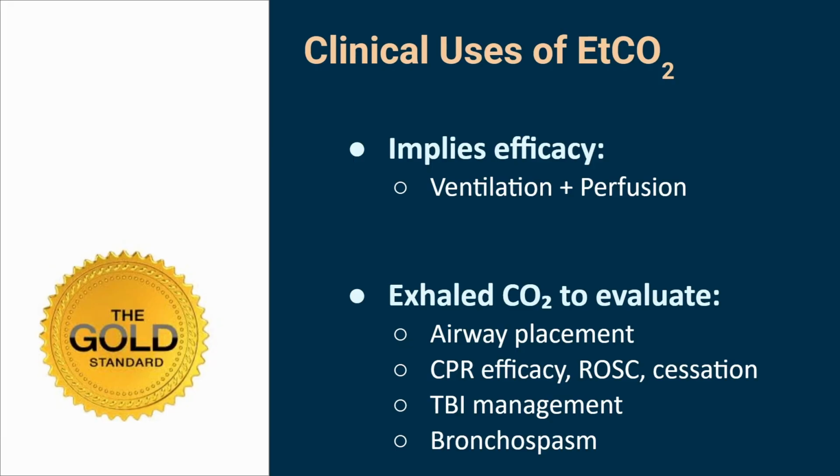So it's the gold standard for iGels, gold standard for all airways. It's essentially the gold standard for saying, hey, I think ventilation and perfusion are working because I can see the end tidal. So that's why we're going to put it on every patient in student world. It's also super good for CPR efficacy. That's a registry question all day. I know that because it's an AHA question, if you remember from BLS. Well, maybe you wouldn't. That might be an ACLS question now that I think about it.